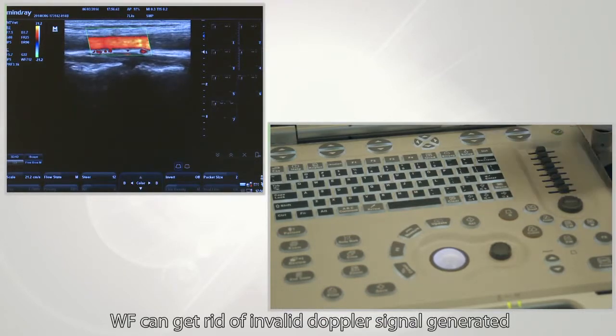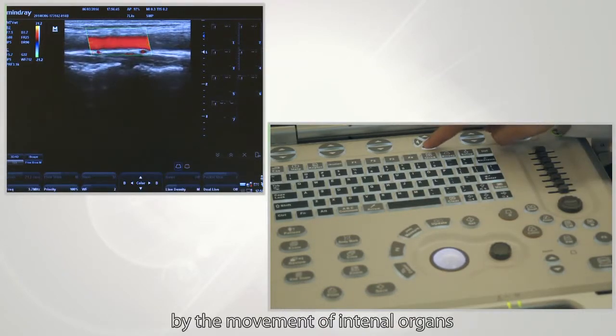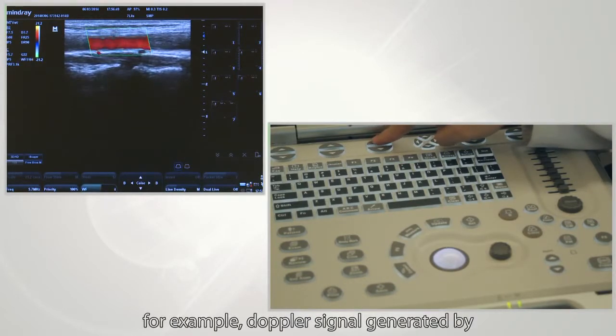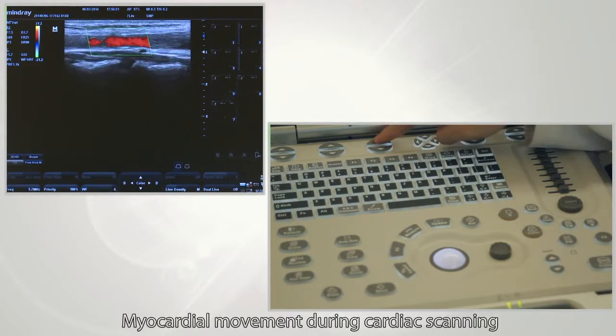WF can eliminate invalid Doppler signals generated by the movement of internal organs — for example, Doppler signals generated from myocardial movement during cardiac scanning.